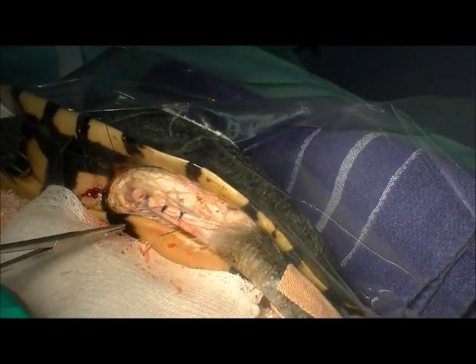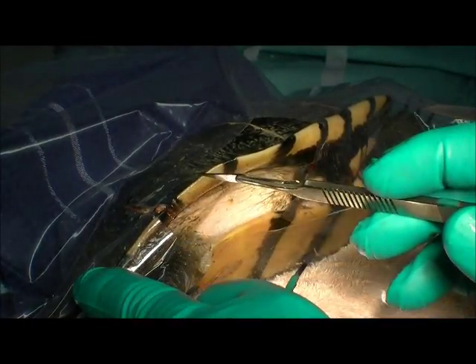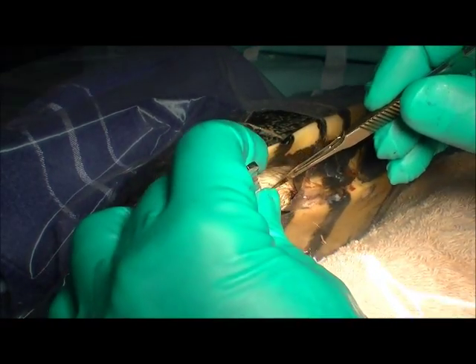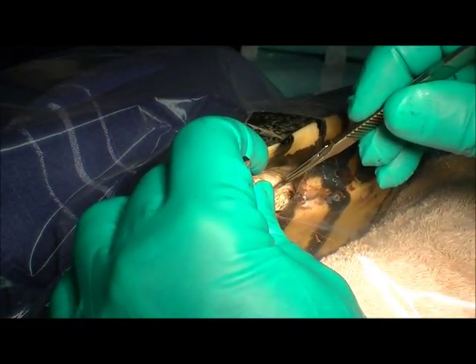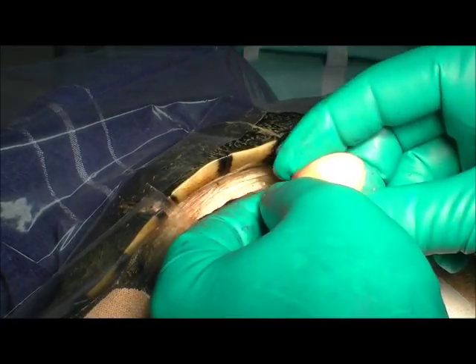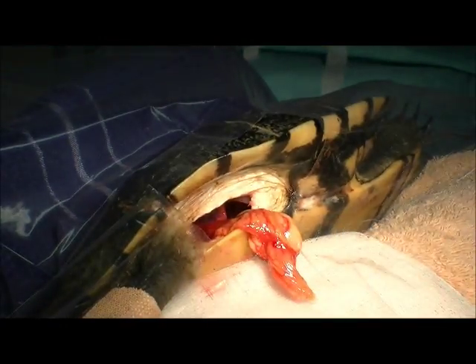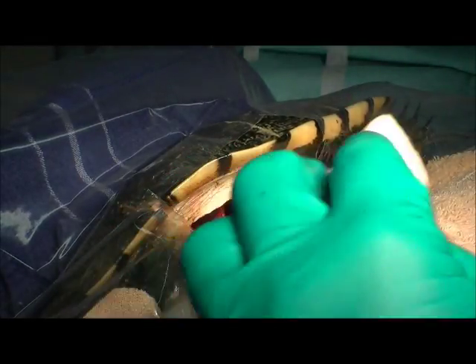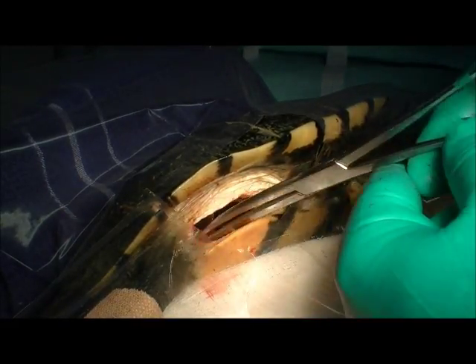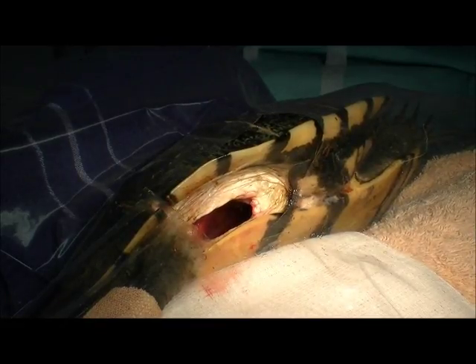Roll her over, set her up on the other side, and pretty much repeat the process. So we've rolled her over and we're now going to go in through the right-hand side — this is the side with the more severe fracture in the shell, which you can see just here. We're going to fix that after we've done this surgery with a bit of wire, and we'll video that too. Making the incision in the skin just like we did on the other side, exposing the muscle, going down and getting these eggs out. That's 16 — and I think that's our last one. So that's worked out pretty well: 8 from one side, 8 from the other. We'll tuck all this back in — it looks pretty good in there. We'll close up this side, and then we're going to fix that shell fracture.